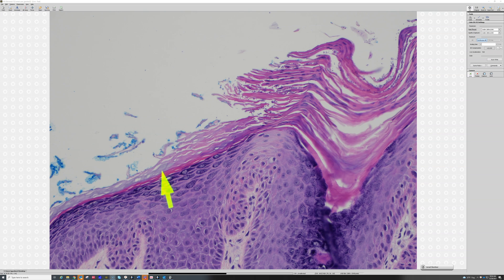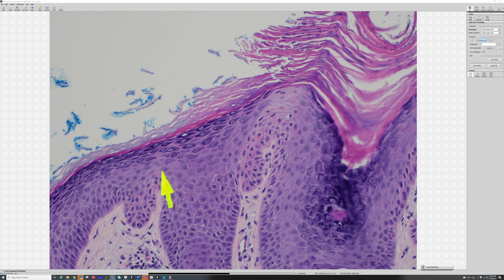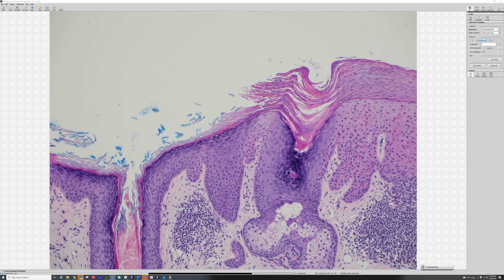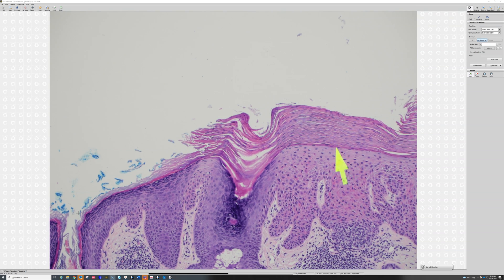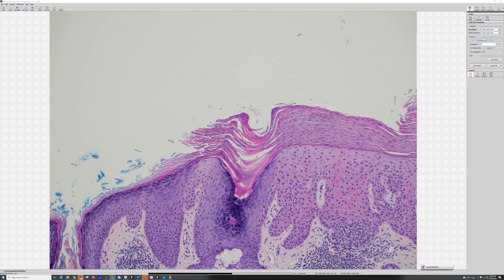This process is called lichenification or lichen simplex chronicus — it's a reactive thickening of the epidermis from scratching. Most people who have actinic keratosis or any other skin lesion scratch and pick at it. This is a nice contrast: when you have parakeratosis, you usually have very little or no granular layer, and when you have orthokeratosis, you usually have a granular layer — they go hand in hand.